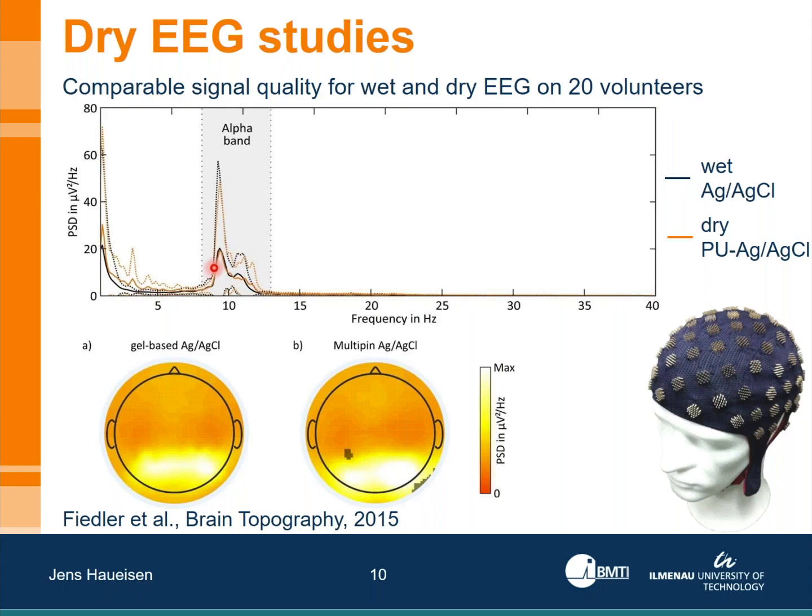And you see the nice alignment of the two curves, the wet and dry recording. Same holds actually also for the standard deviation, which you see as dotted lines here. There is a slight difference I would like to point out in the low frequency band, where the wet and dry give you slightly different results. And that is something which is noticeable also in other studies.